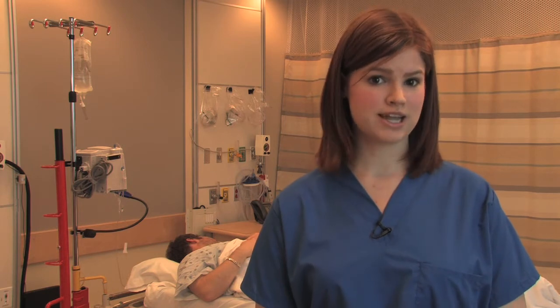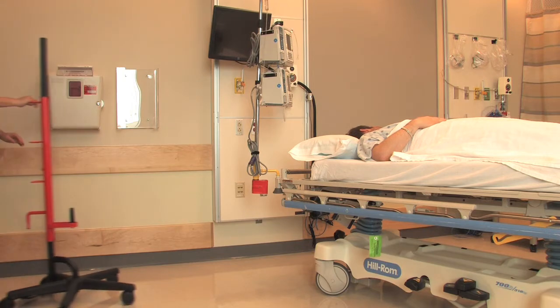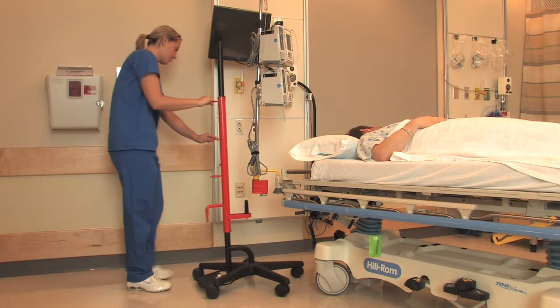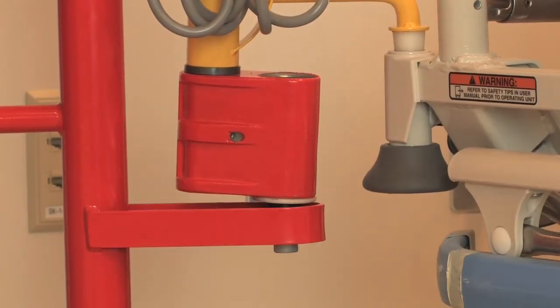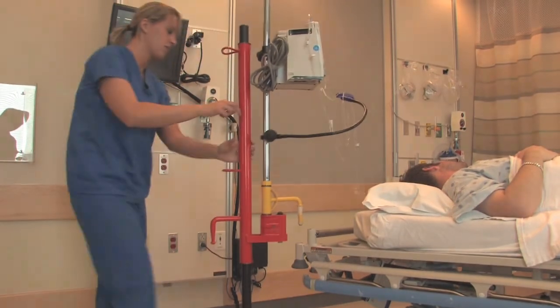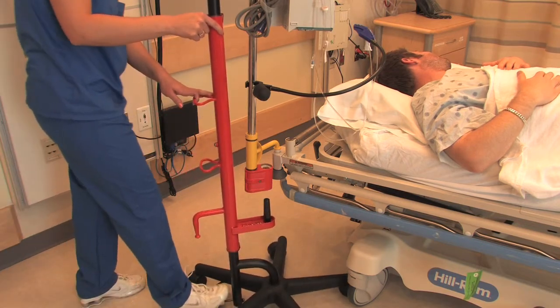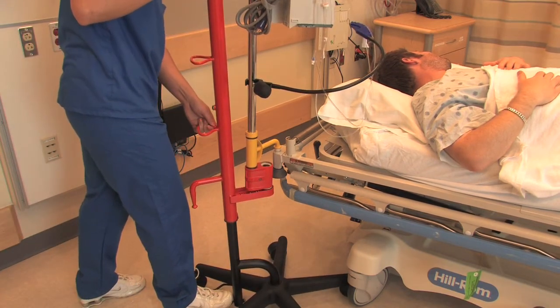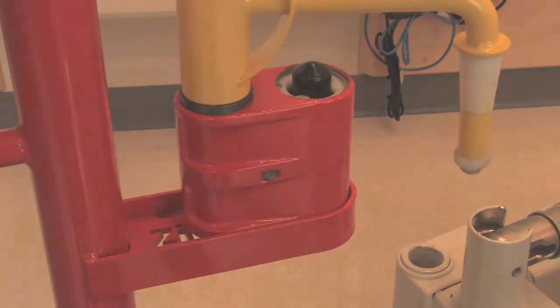In order to place the IV transfer pole back onto the ZipLift stand, the process is just as simple. In order to remove the IV transfer pole from the bed, simply grasp the handles, align the ZipLift stand black receiver pin, brake, and release. Once engaged, continue raising until the IV transfer pole is released from the bed. In the event that the orange receiver block does not completely seat within the ZipLift stand recessed pocket, do not be alarmed. Simply grasp the pole and rotate until seated on the stand.